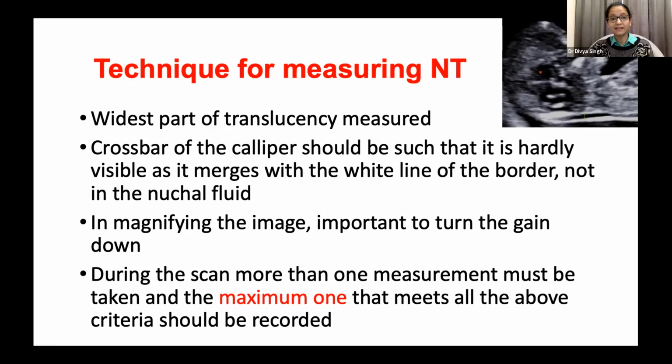Sometimes when you magnify the image, I think somebody brought it up last time as well, it's important to turn the gain down a bit so that the margins don't appear very fuzzy. If they appear very fuzzy to you, you can turn down the gain a bit, and then you can see these white margins better. Also, it's a good practice to take more than one measurement during scanning, and the maximum measurement of the NT, which meets all the above criteria, should be recorded as the final measurement.